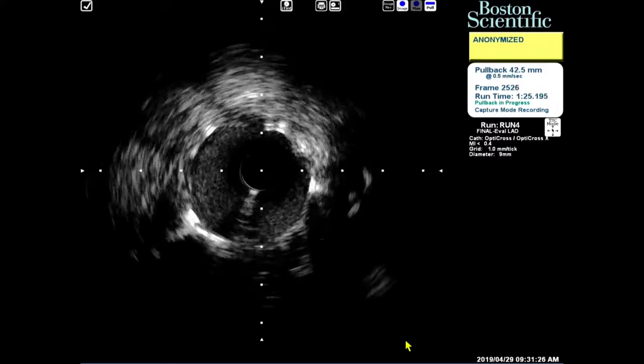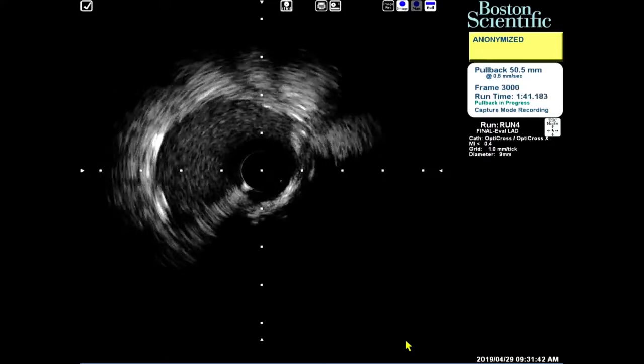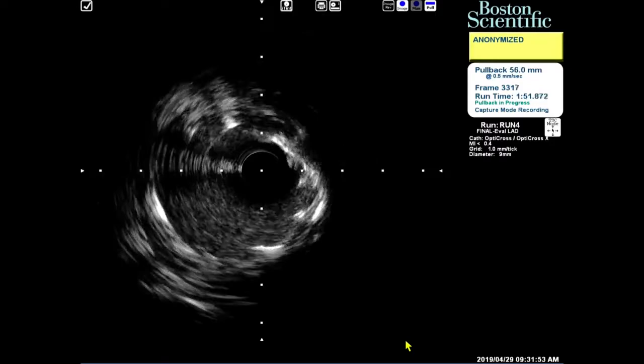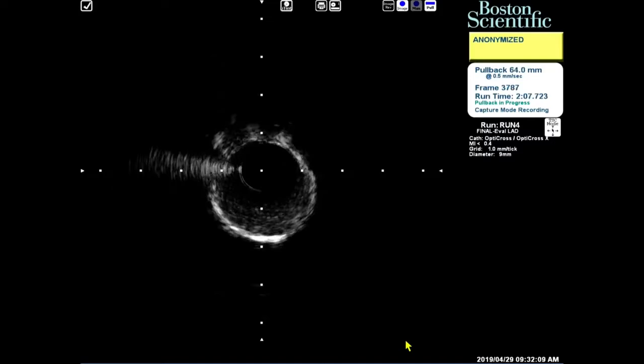Here is this left main bifurcation. And left main here, the stent size is good. I implanted a 3.5, 18 stent. I applied 3.5 up to 20, 24. Here is the left main ostium. Too strong. Ready? Ready?